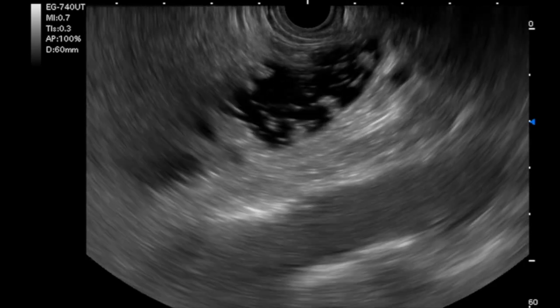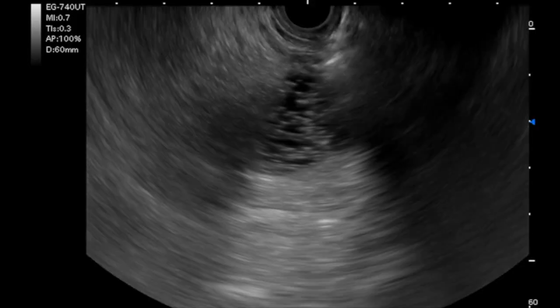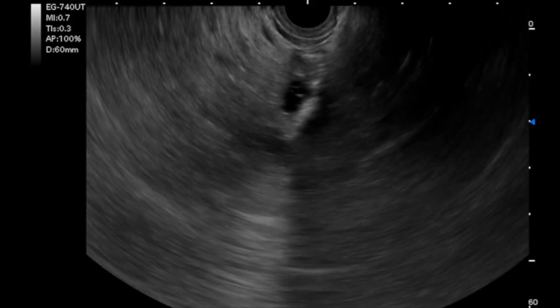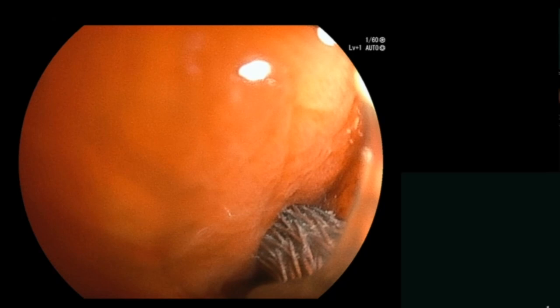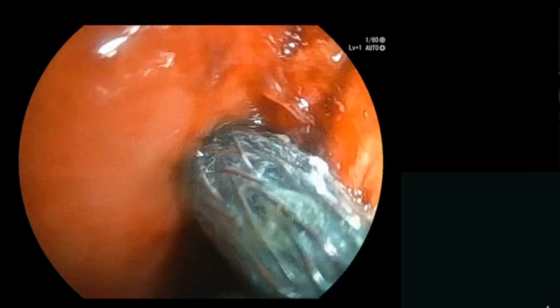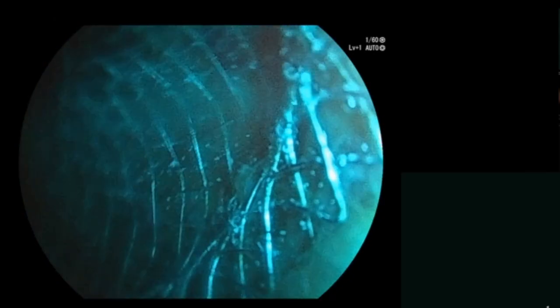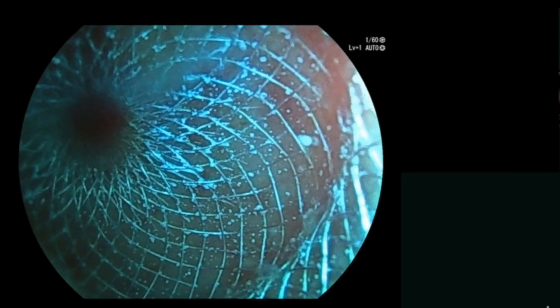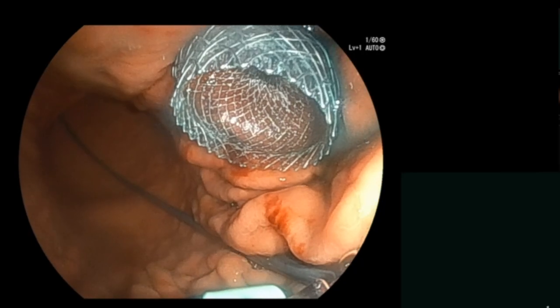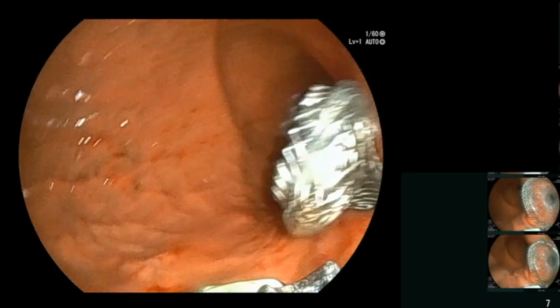The jejunal loop was confirmed on EUS and by fluoroscopic view. After identifying an optimal jejunal loop, the distal flange of a 20mm diameter by 10mm saddle length lumen-apposing metal stent was deployed within the jejunum, and the proximal flange was released into the stomach on endoscopic view to create a gastrojejunostomy, rather than a blind intracavitary deployment. The release mechanism was well visualized in real time, and the lumen-apposing metal stent could be seen unhindered post-deployment.